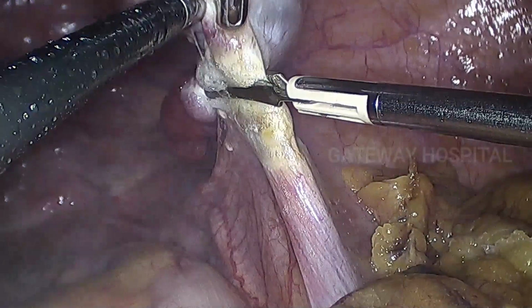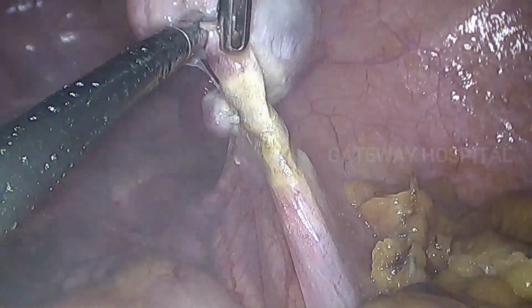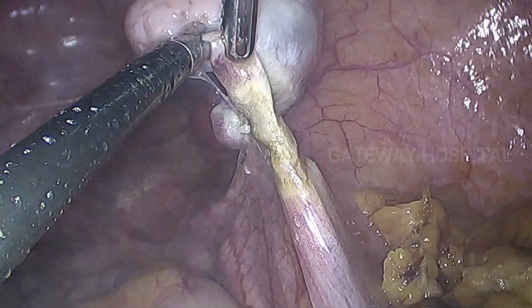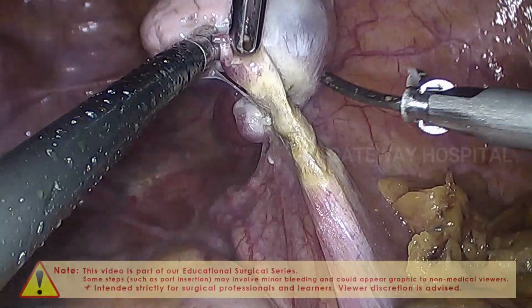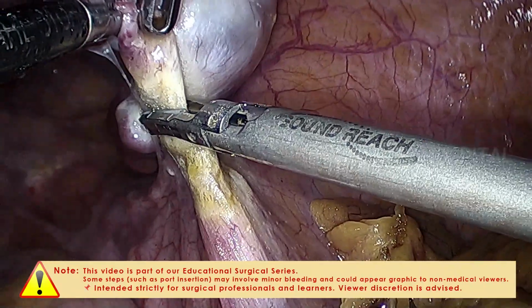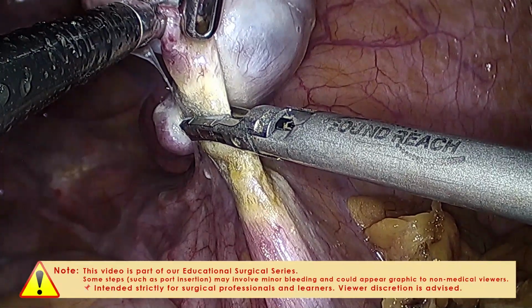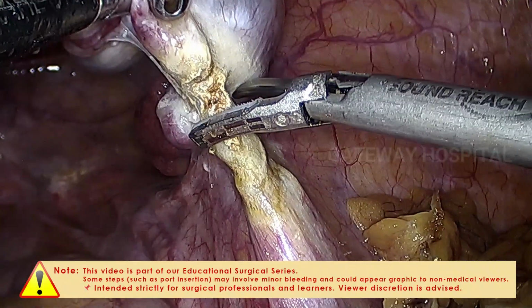And while sealing, you have to seal the vessel at multiple places so that there will not be any chances of post-operative bleeding. So seal at least 3 places, and while dividing, you go close to the specimen side and divide the pedicle.